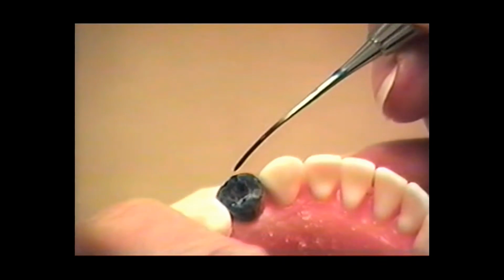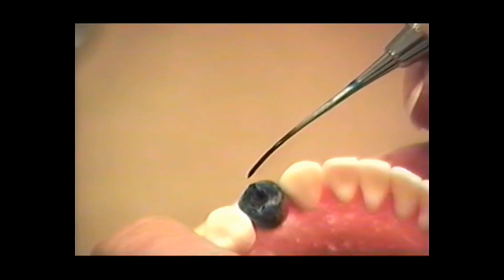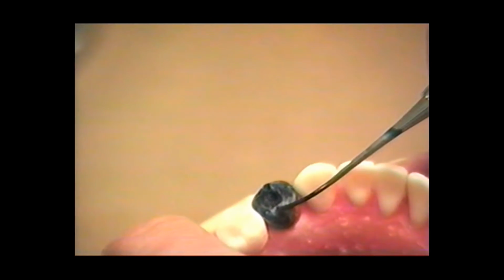Okay? But the one on the cusp tip is good, but it's heavy because I've dented. I don't know if you can see that. There's like a dent in the wax, so that means it's too heavy. You have to definitely get rid of this triangular ridge contact. I like to get rid of the lingual contact. So that's what you do.